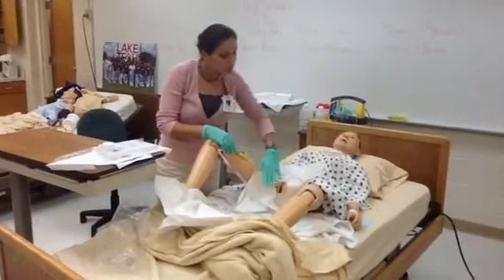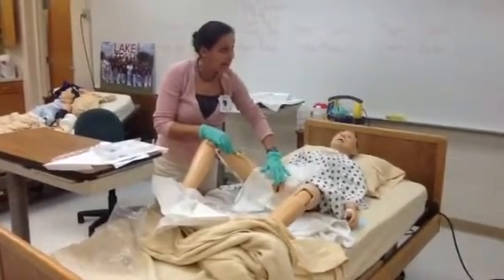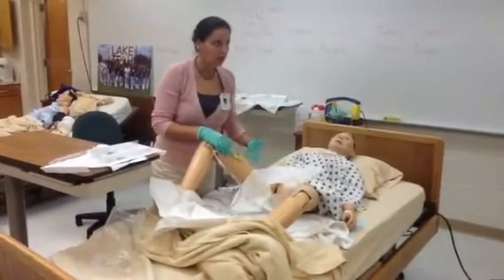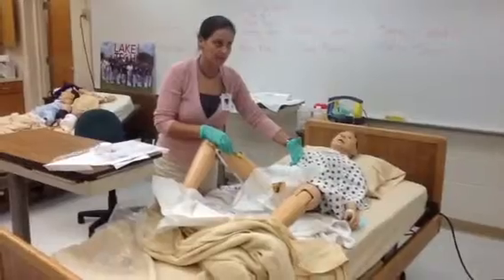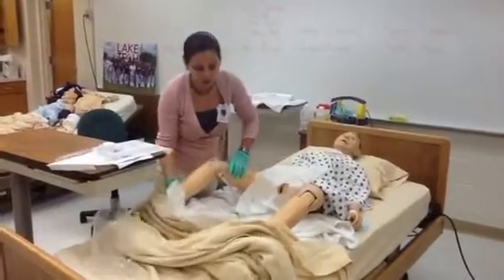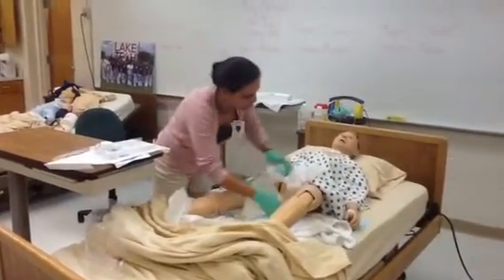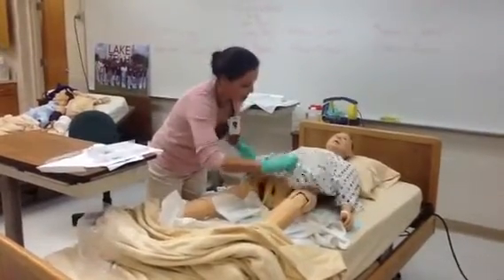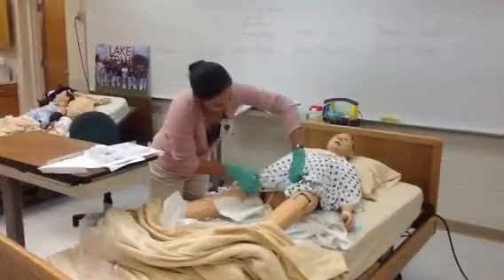Okay, we need to be sure that we've got enough slack here and we are secure. So we don't want anything to be pulling, but we can't leave enough rope out there for them to hang themselves with, all right? So we want to make sure that this is nice and still. We're going to go ahead and remove this. Some modesty here.